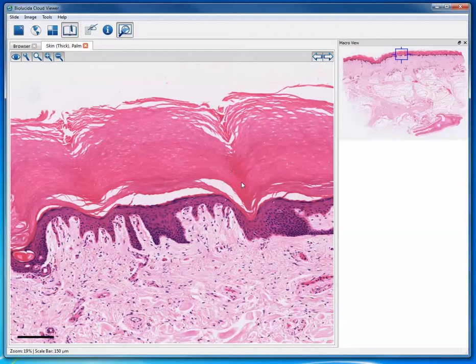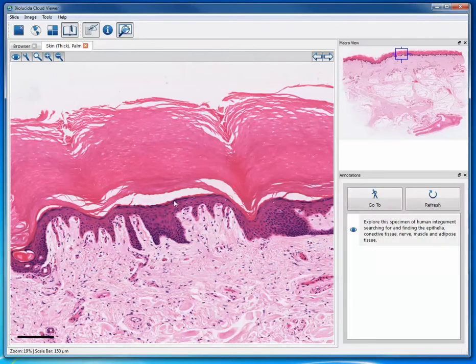One of the first questions you may have in the first module quiz is to identify the epithelium here, and we might put a dotted line and say all the tissue from the dotted line where my cursor is out. And this is stratified squamous keratinizing epithelium, and has many layers of cells and so forth. So the question in Blackboard and in here may be to identify this tissue, and you would identify it.